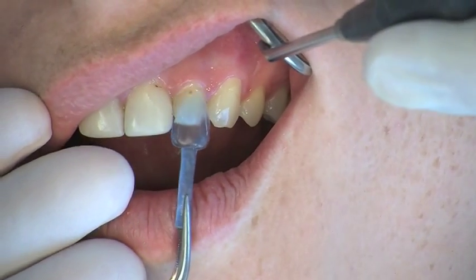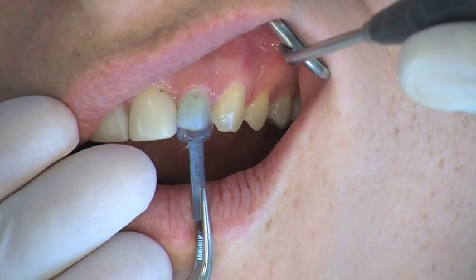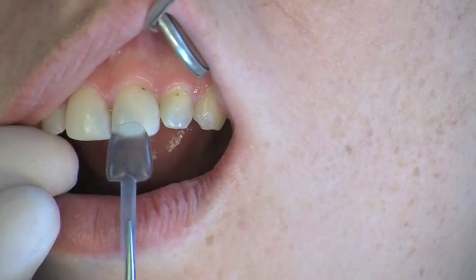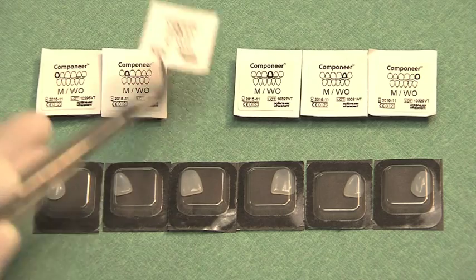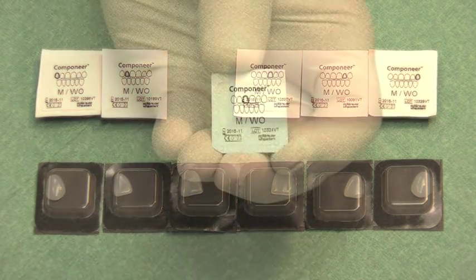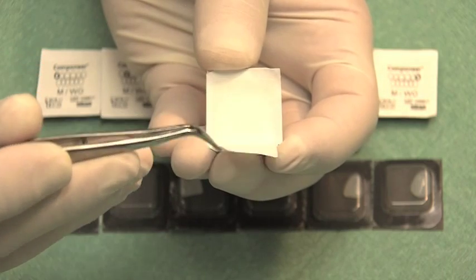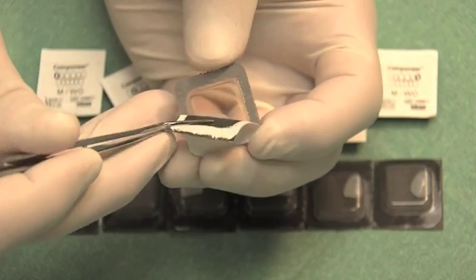The shape and size of the Componeers to be placed can be determined by using the contour guide. The shapes match the corresponding Componeer perfectly. The Componeers are individually packaged, and the sheet on the reverse side serves for patient documentation. The Componeer is removed with a pair of tweezers.